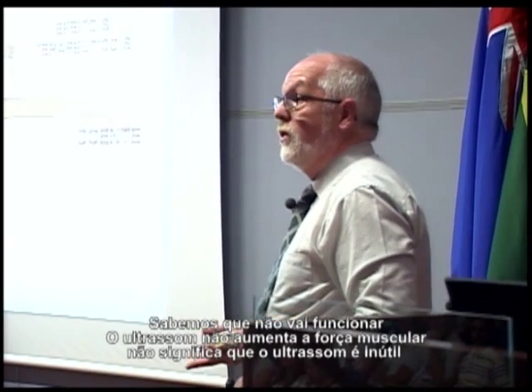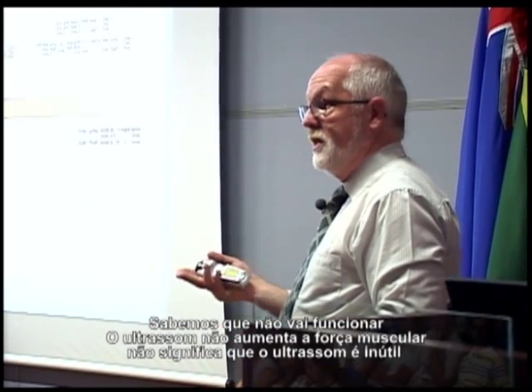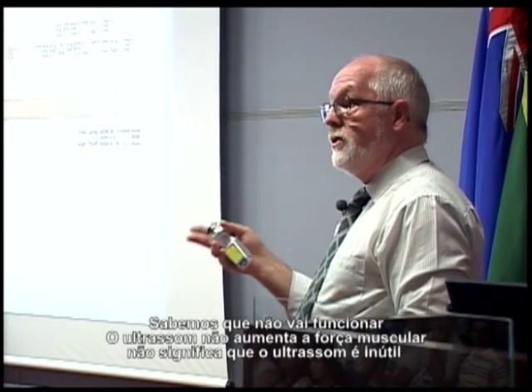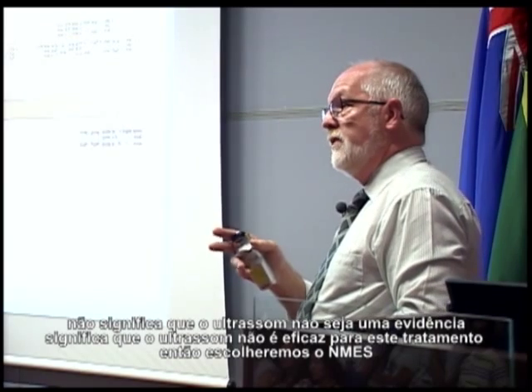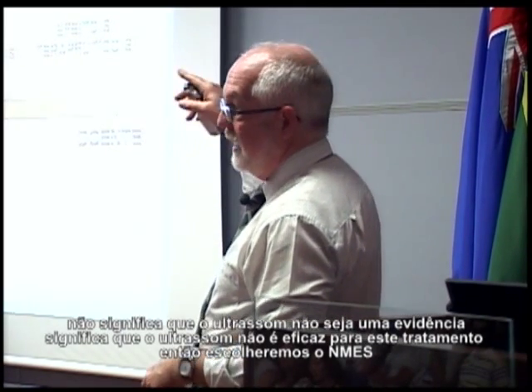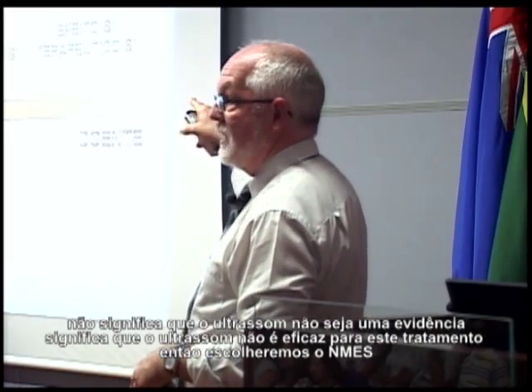We know it's not going to work. Ultrasound does not increase muscle strength. It does not mean that ultrasound is useless. It does not mean that ultrasound is not evidenced. It means that ultrasound is ineffective at doing that job.